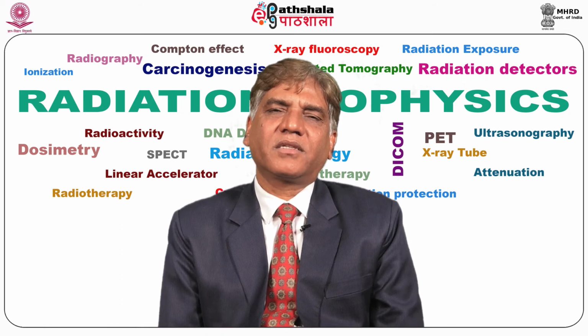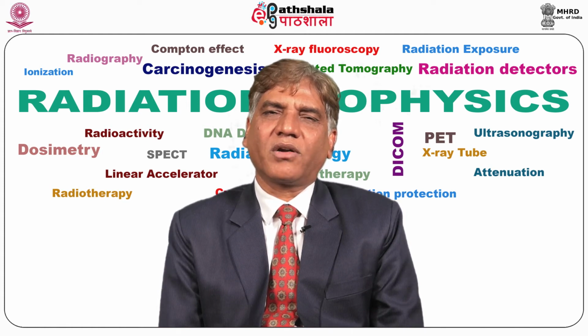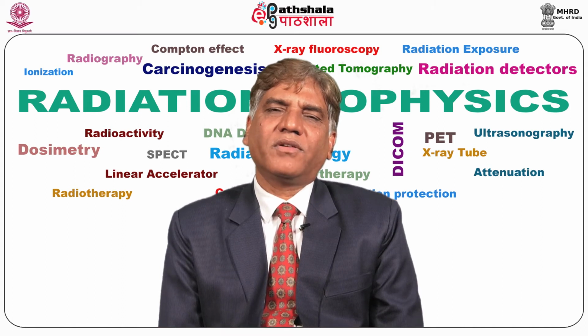This electrical signal is detected by using a TFT, thin film transistor array, which is divided into detector elements and arranged into a rows and columns matrix. Electronic components include the TFT, a charge collector electrode, a storage capacitor, and a TFT electrical switch. It has 3 connections: the gate, which is the on and off switch, the source attached to the storage capacitor, and the drain attached to the drain lines. So, how does the TFT work?